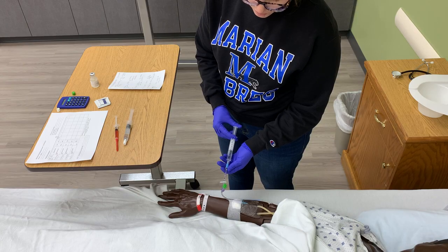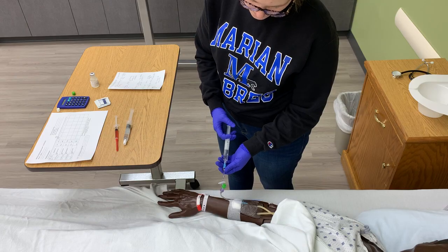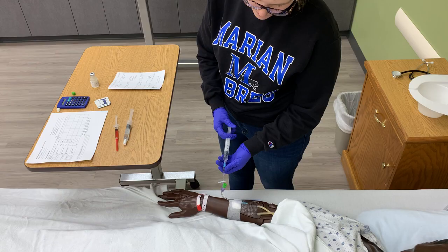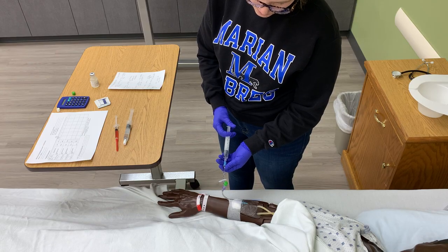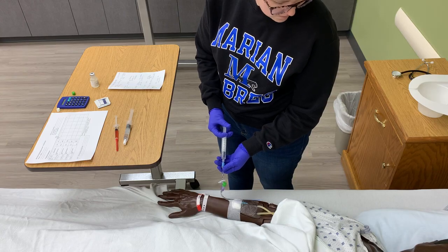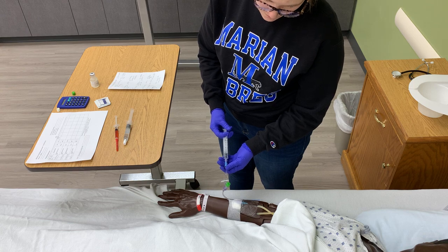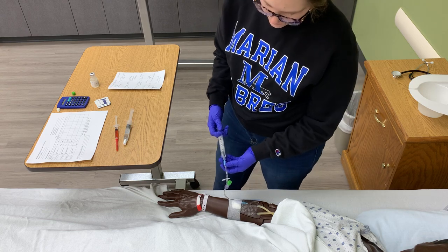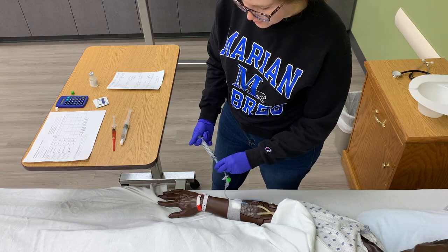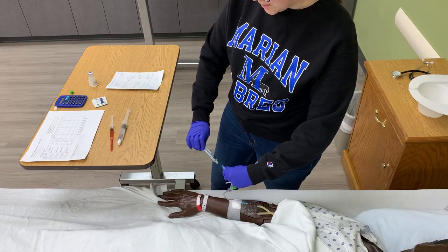Okay, we have just a couple more milliliters to go. Okay, pushing another ml. Another. One more. Okay. There we go. So we've done our first flush. I'm going to remove my syringe.